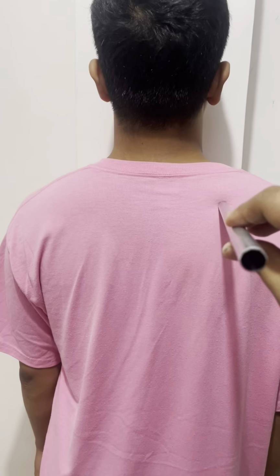Projection is PA projection. Perpendicular exit the midshaft of the clavicle. Structure shown and evaluation criteria are same as for AP projection. Next projection is PA axial projection. The central ray is angled 15 to 30 degrees caudad. Structure shown and evaluation criteria are same as described previously for AP axial projection.